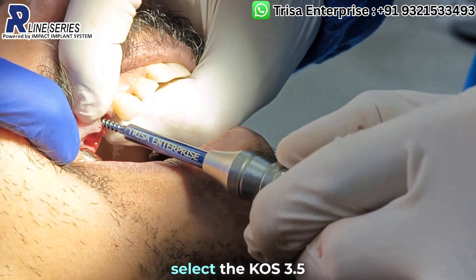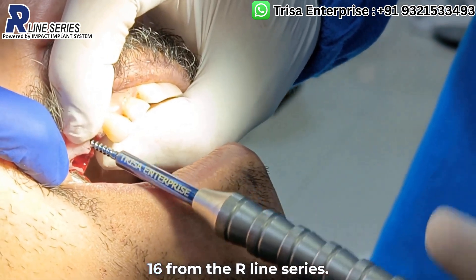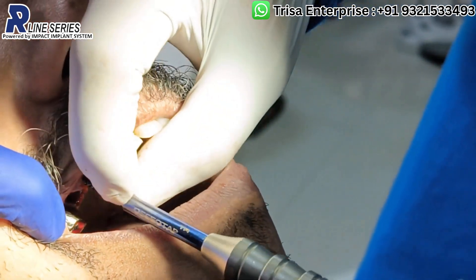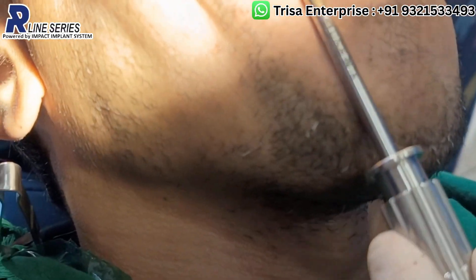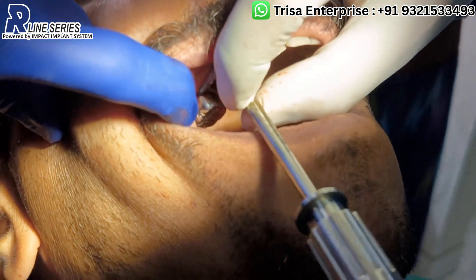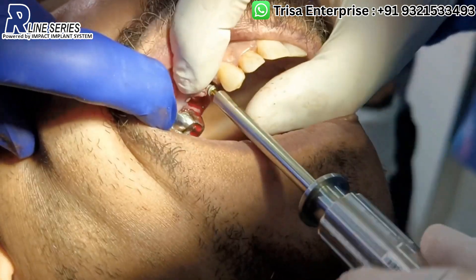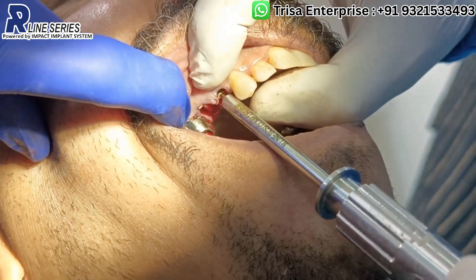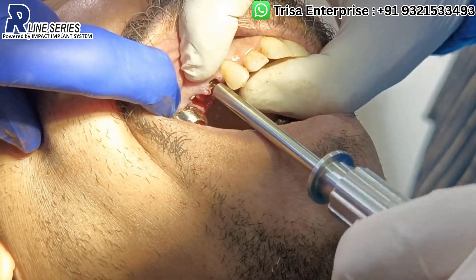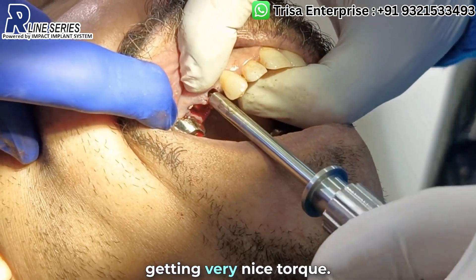For this reason, I will select the KOS 3.5-16 from the R-line series. As you see here, I am getting very nice torque.